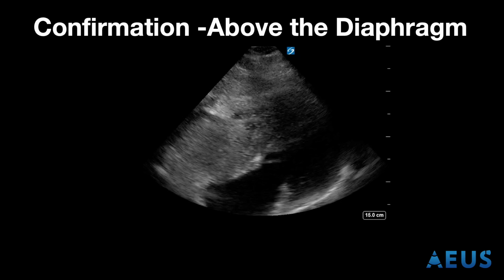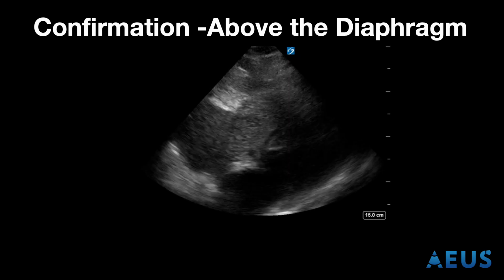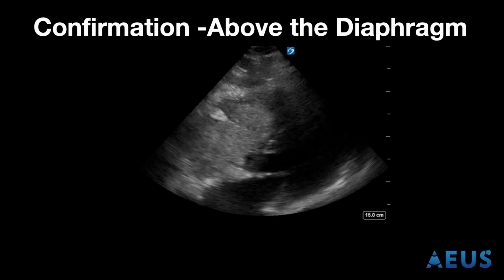Confirming the rapid atrial swirl sign should be done using a subxiphoid or apical four-chamber view. Occasionally, if your view is suboptimal, you may have difficulty detecting those microbubbles created by your saline flush. One method to alleviate this is to use a three-way stopcock and 2 syringes to create an agitated saline, and flushing this can be much easier to detect.